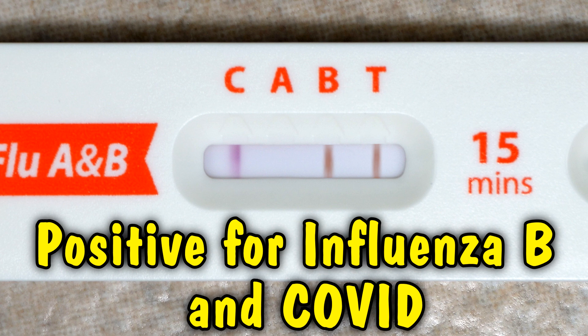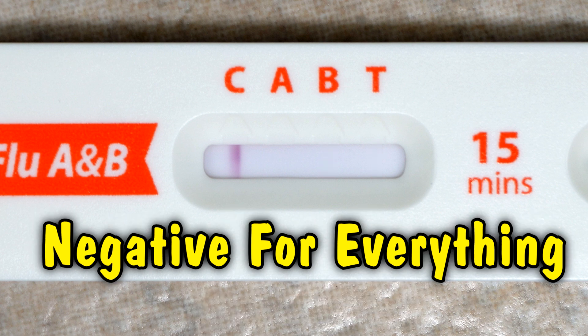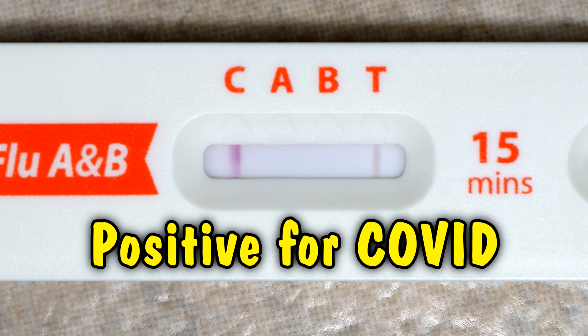It's possible to have more than one of these things. If you have a line under C but nothing beside A, B, or T, then the test did not detect any of those things in your sample. Any faint lines under A, B, or T need to be treated as full lines, so look carefully and make sure you squint.